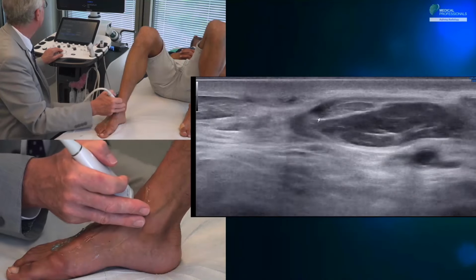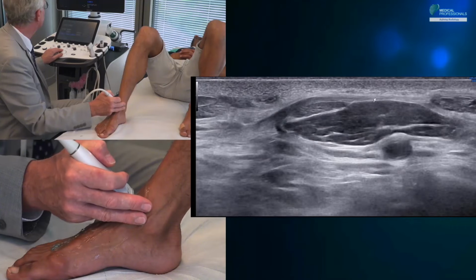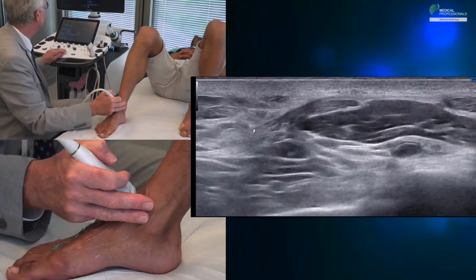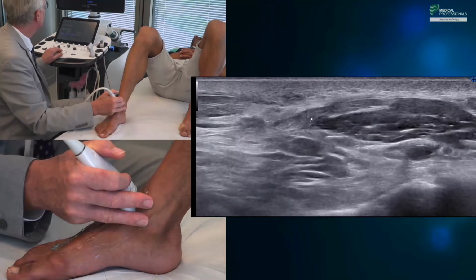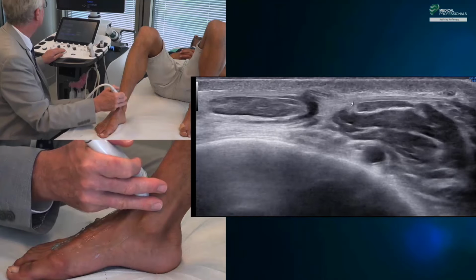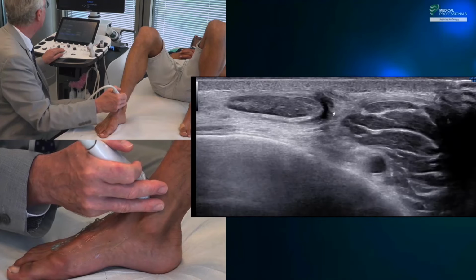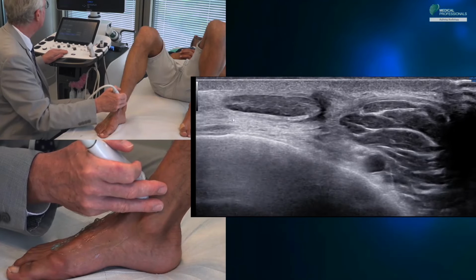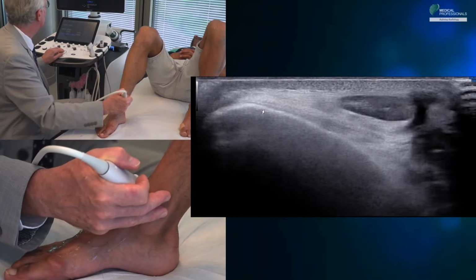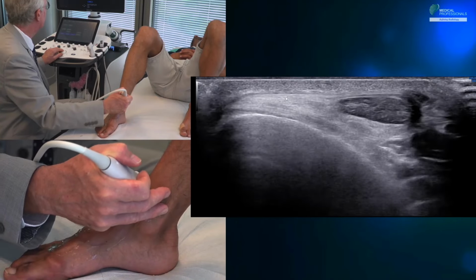Then we go up a little toward the leg, and we find here a structure that we can see very well in this patient. It is the superior retinaculum of the extensors. We see that these extensor tendons are pressed against the tibia by this fibrillar structure, which is a thickening of the crural fascia that comes to press these tendons against the tibia. Otherwise, with each dorsal flexion of the ankle, there would be a gap between these tendons and the cortex, with tendons protruding under the skin.